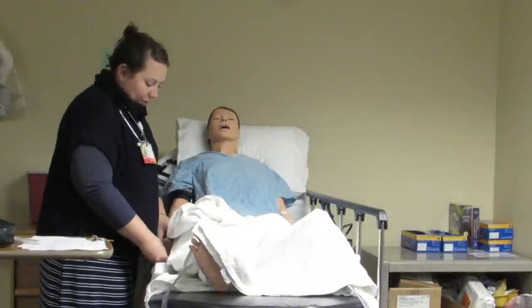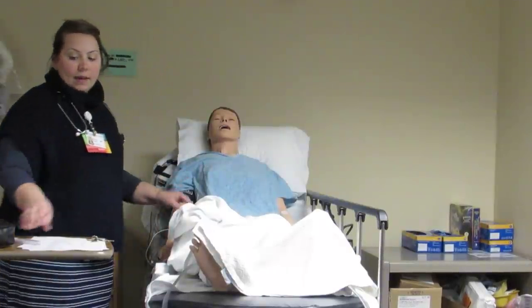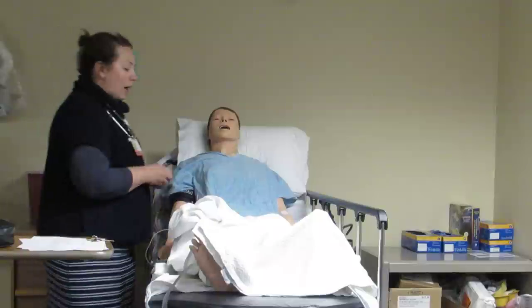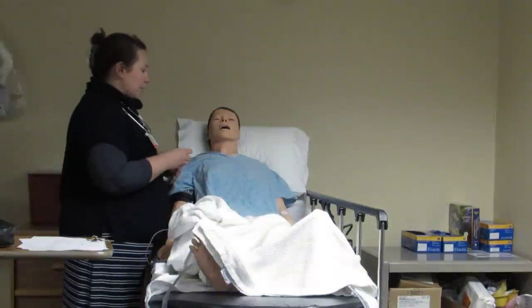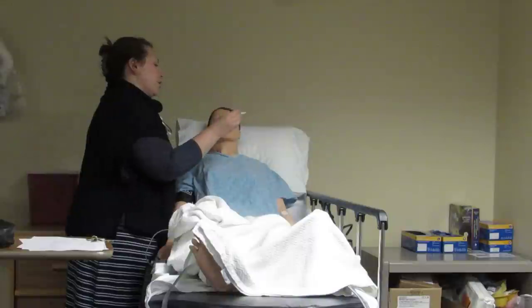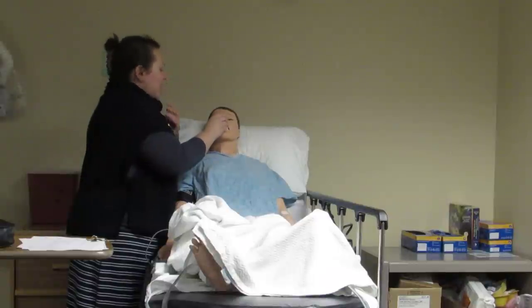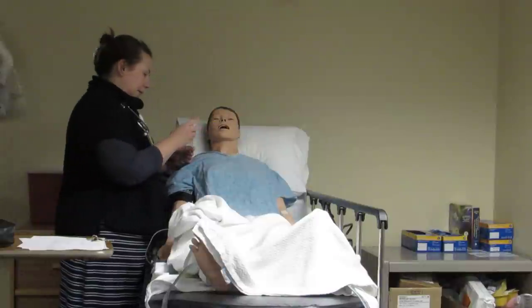I'm going to leave that on for about 10 or 15 seconds until I get a nice consistent number reading on that. In the meantime, I could take her temperature as well. Ms. Smith, I'm going to put this under your tongue. I'm going to ask you to close your mouth completely around it until it beeps. I'm going to turn it on, put it in the pocket on the side of her mouth, kind of under her tongue there, and I'm going to ask her to close her mouth, and then it's going to beep.